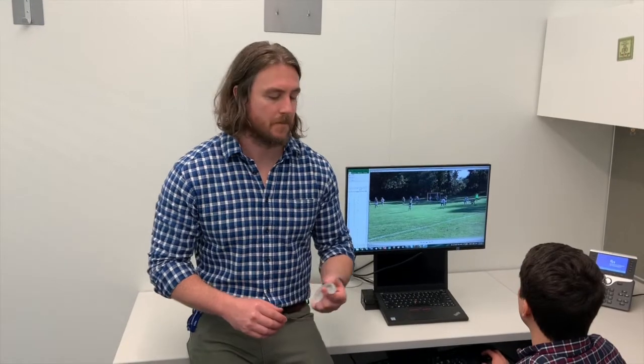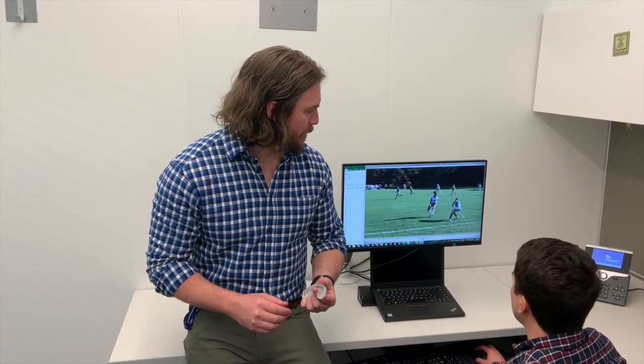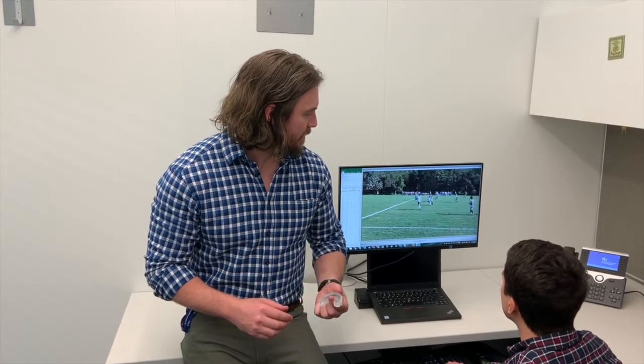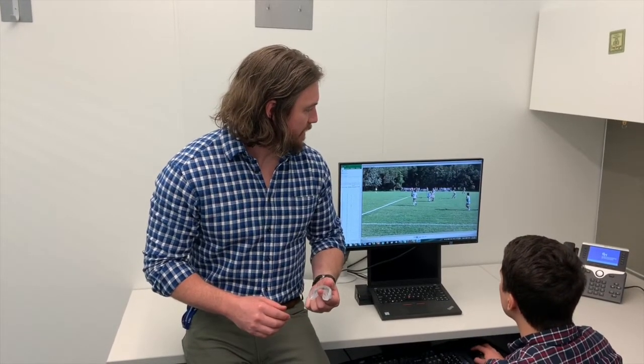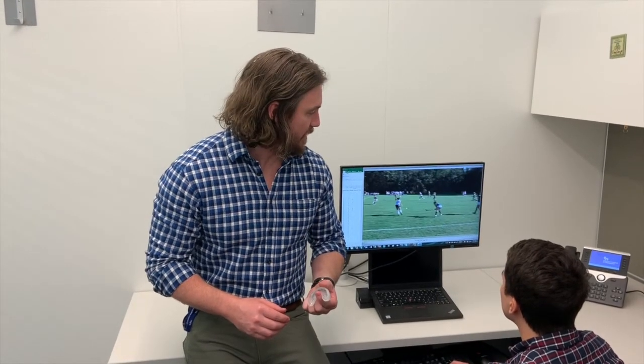When we deploy the mouthguards in a game we also film the game so that we can compare the sensor data to the video. For each sensor-recorded impact we go to the appropriate section of the video to see if that impact can be observed. If it can be observed then it's known as a true positive. However, if it cannot be observed it's known as a false positive. Video analysis is an important step to validate the sensor data.